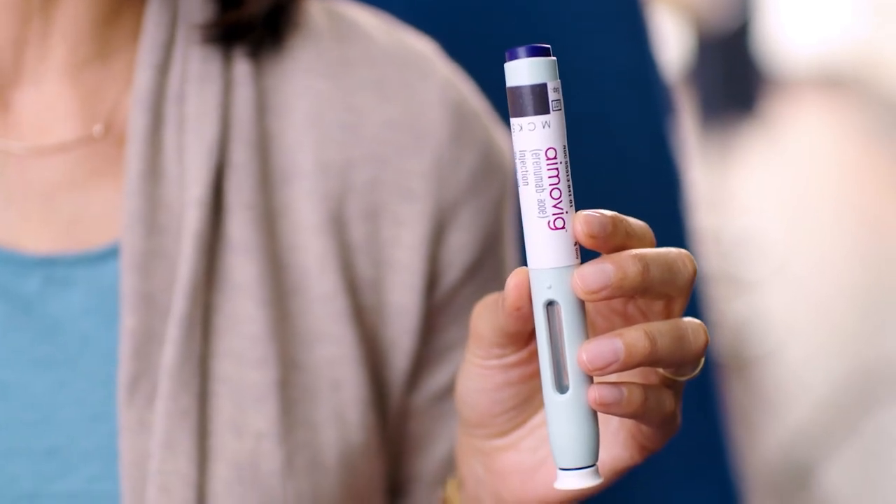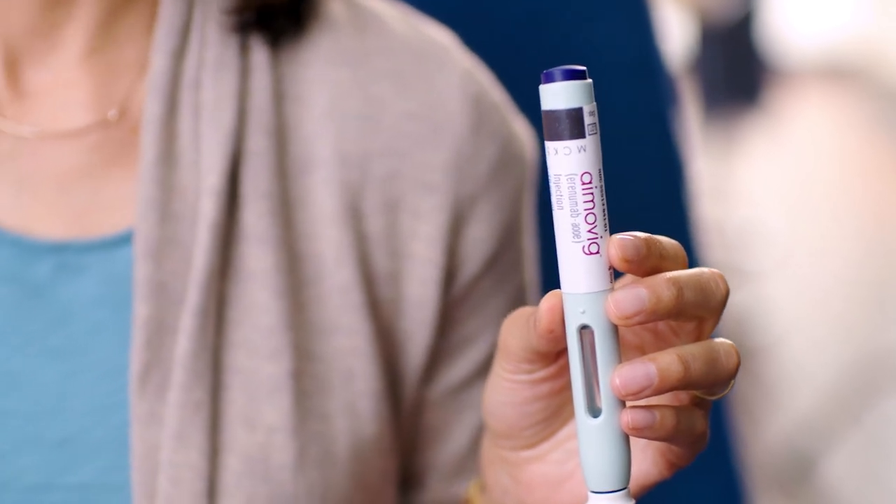There are two different auto-injectors for Amovig. You use them in the exact same way — they're just different colors depending on what amount of medicine they hold. If your doctor prescribed you 70 milligrams, you'll get this auto-injector with the purple start button and a white cap. If you were prescribed 140 milligrams like me, you'll receive this auto-injector with a gray start button and an orange cap.